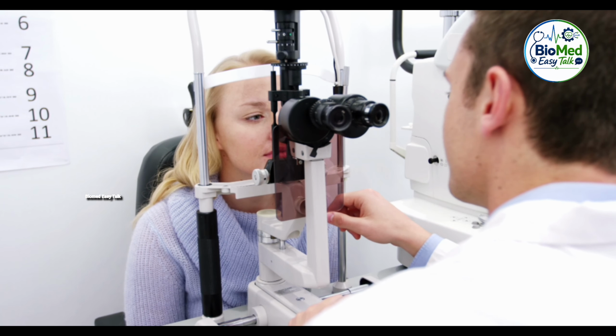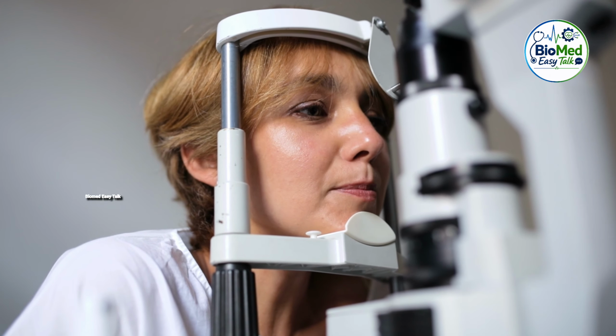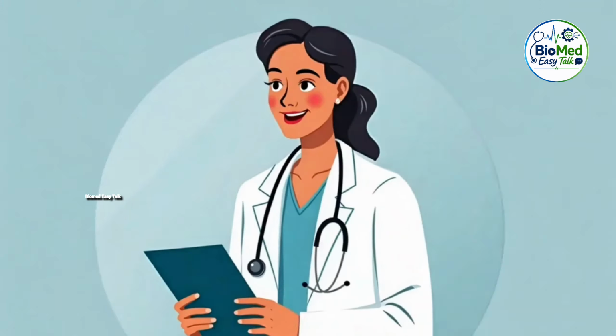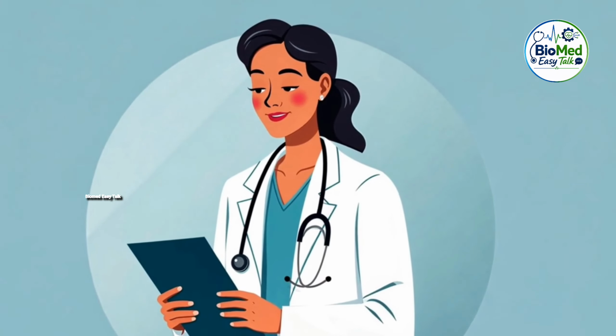It allows the eye specialist to direct a thin bright light into the eye to do the work of examining the tissues in a magnified 3D view.